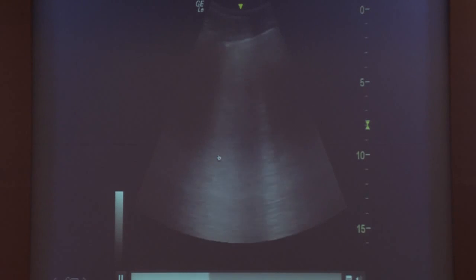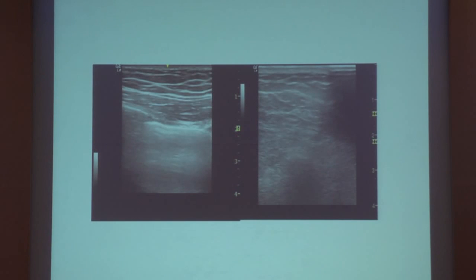This is an extreme patient who has severe pulmonary edema. You can see the lung is almost completely whitened out by these thick B lines. It represents a complete whiteout on the X-ray as well. Talking about X-rays, if you need to evaluate a patient with X-rays, obviously you need to call the radiographer, who needs to shoot the picture, and you need to get the picture on the screen or a hard copy. All this is going to take time. But you have a machine by the side. You know the answer within a few minutes' time if you have basic skills.